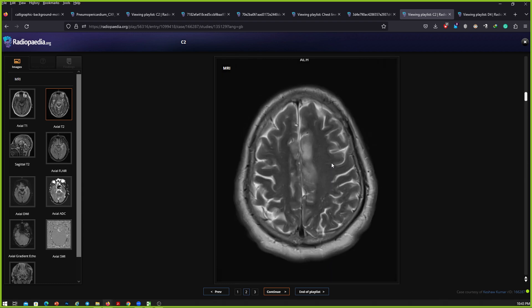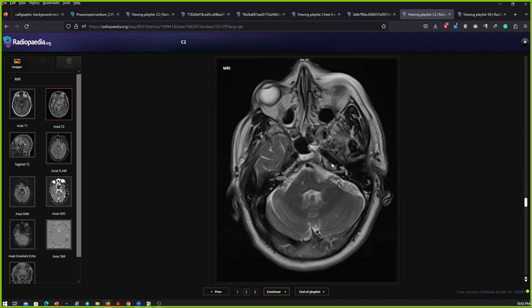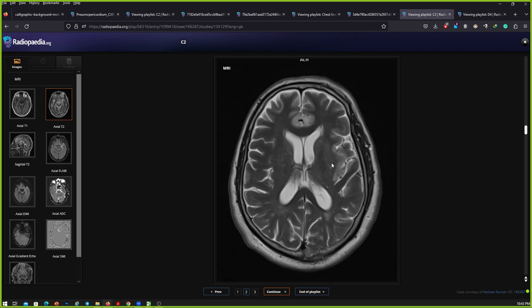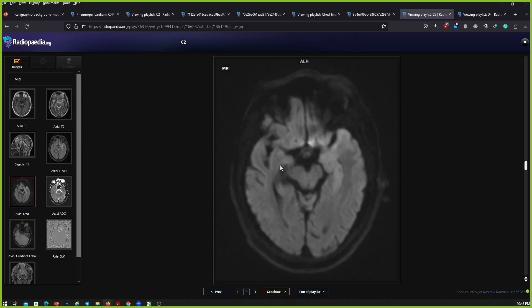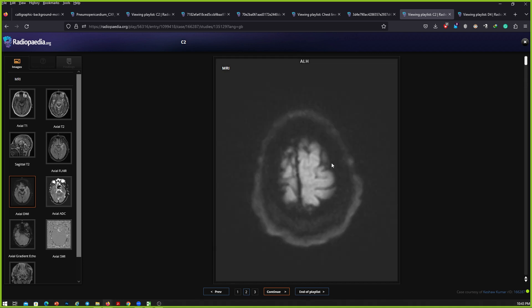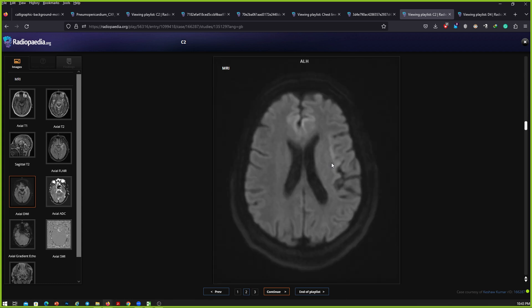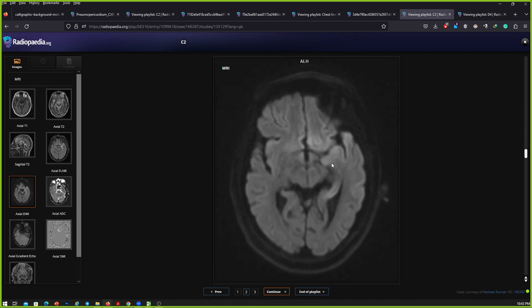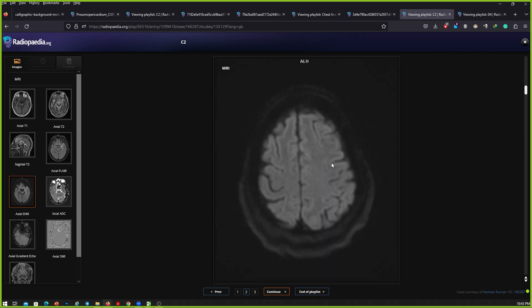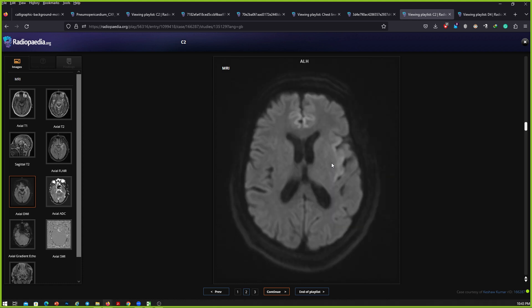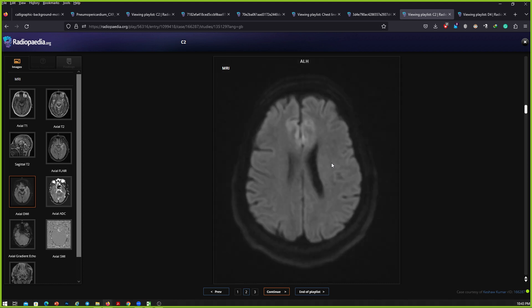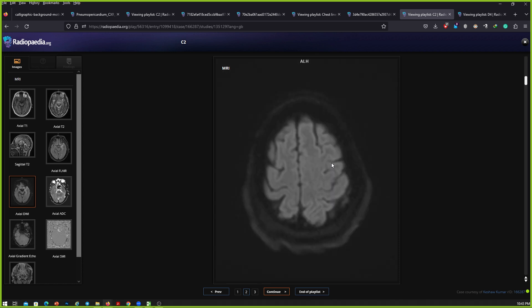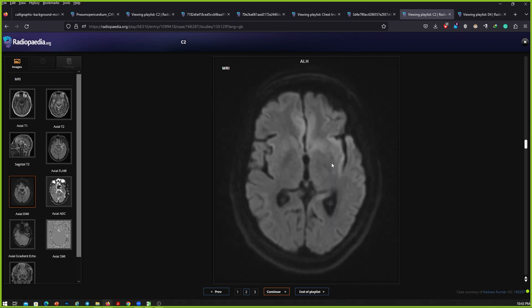My provisional diagnosis will be acute infarct. I would like to confirm the findings on diffusion-weighted sequence. On diffusion-weighted sequence, there is some diffusion restriction seen in the involved area, predominantly involving the gyral surface. This looks like acute infarct. I'd like to see the MR angiogram to confirm the vessel involvement.